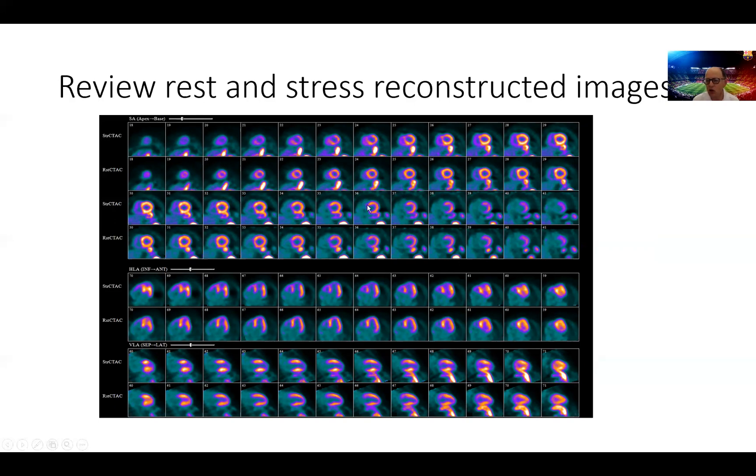Again, this looks like a normal rest study, except for a very minor perfusion defect in the apex that can be either a true defect with a very minor perfusion defect, or it can be just due to physiologic apical thinning, given the highest spatial resolution of the PET machine.